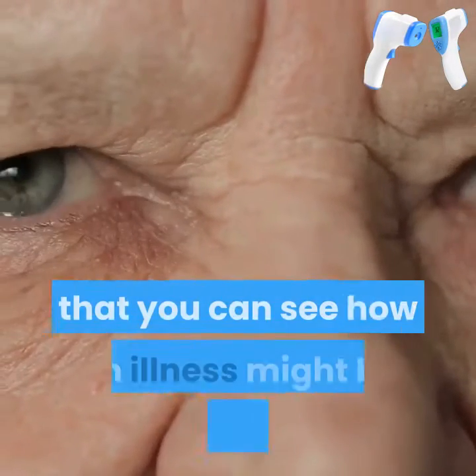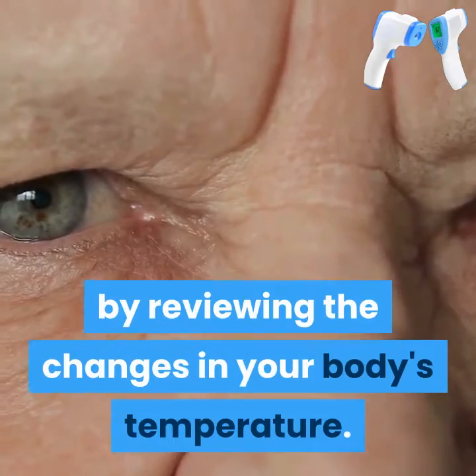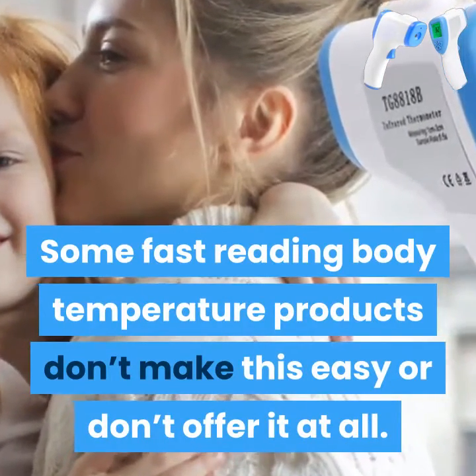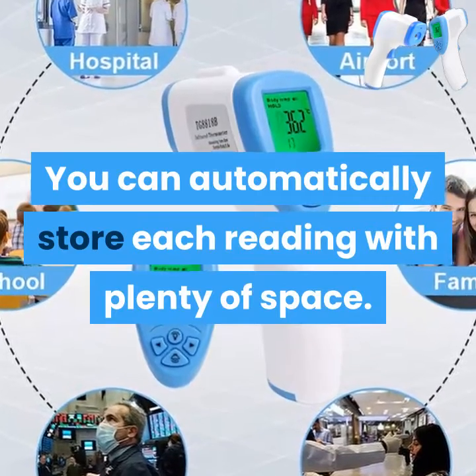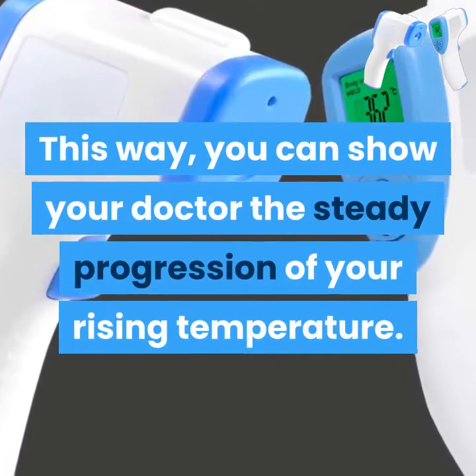Lots of memory. One way that you can see how an illness might be changing is by reviewing the changes in your body's temperature. Some fast reading body temperature products don't make this easy or don't offer it at all. A neat feature with Live Temp Pro is the easy to access memory — you can automatically store each reading with plenty of space. This way, you can show your doctor the steady progression of your rising temperature.